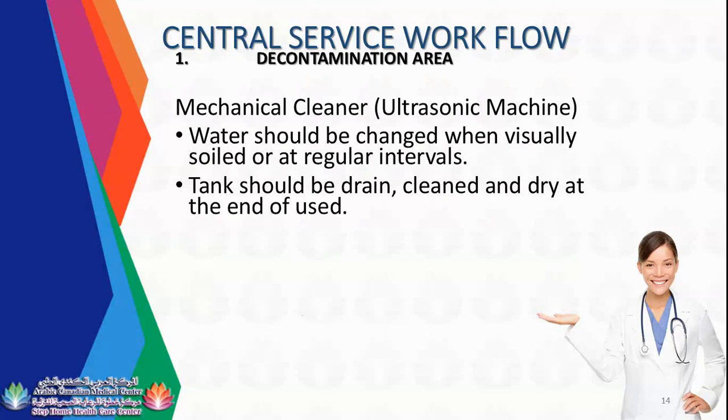The chemical in the ultrasonic machine, guys, is an enzymatic cleaner. Once you are here in our CSSD room, you can see those chemicals. So for this ultrasonic machine, enzymatic cleaner or enzymatic detergent is used. It is mandated to be changed daily and as needed. Because if you have a lot of instruments to be processed, your chemicals will be ineffective in cleaning the soiled instruments.